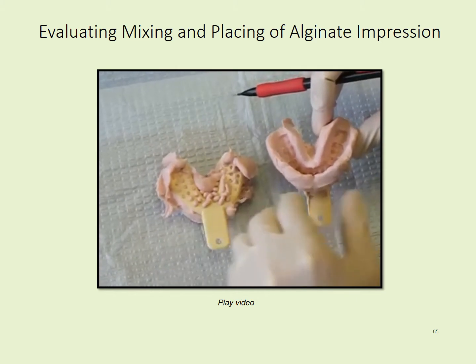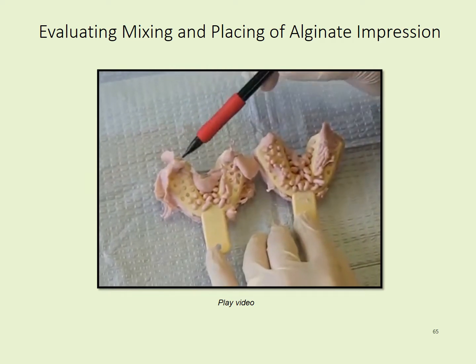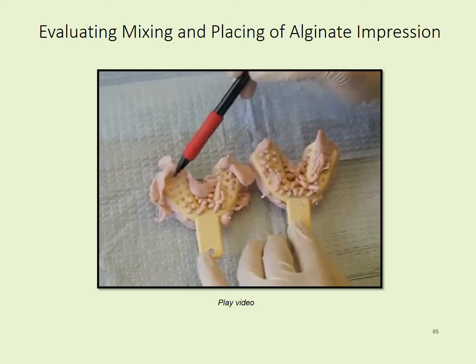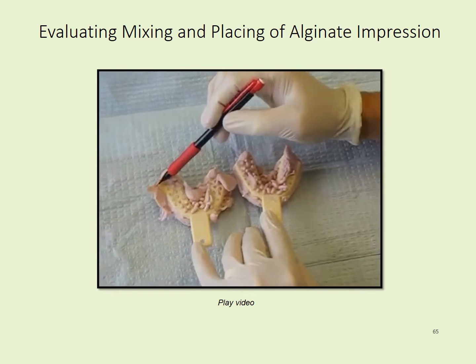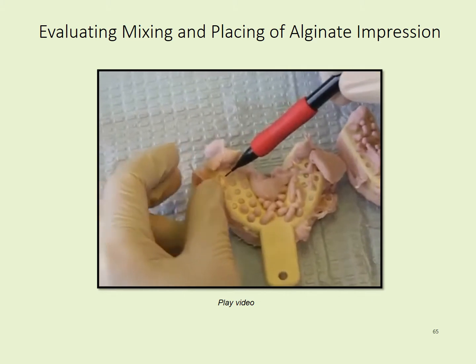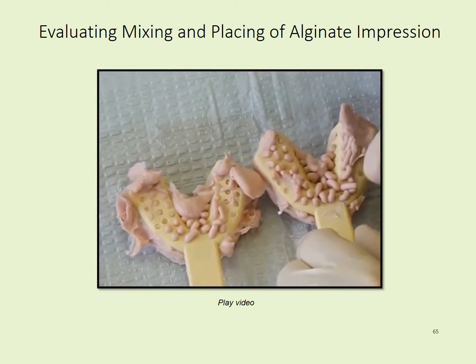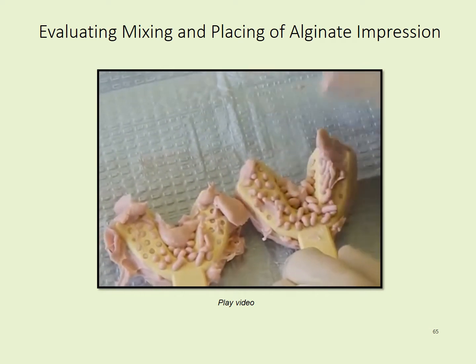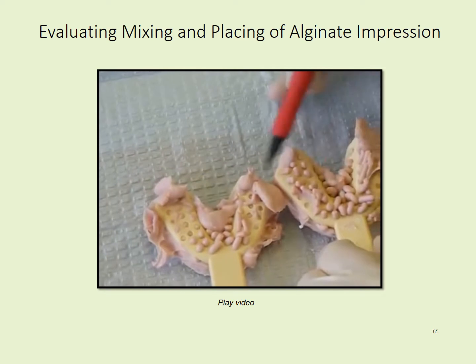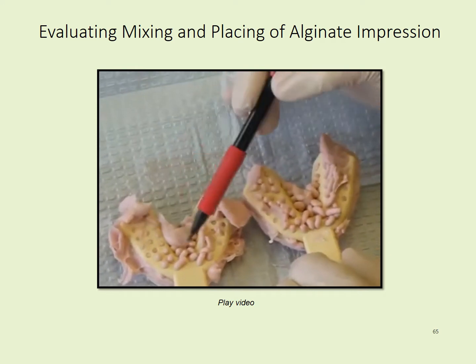On the runny side, you'll be able to see that even though the tray was seated, not all the material made its way or was pushed up through the retention holes. Here on the very back portion, you can see it's almost a concave type of hole, as opposed to the holes here where most all of the material is pushing through, just like those typical Play-Doh models where you put the Play-Doh in, squish down, and the hair comes out. You can see how much more defined these ones are than these, and how they're coming through almost all of the holes, as opposed to the runny model where it's only coming through the front.